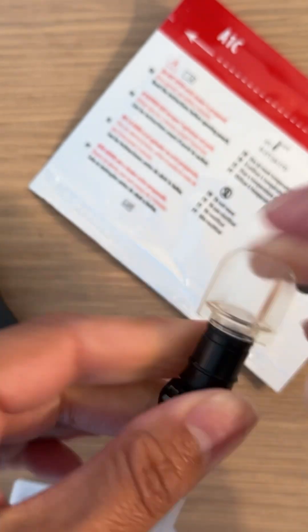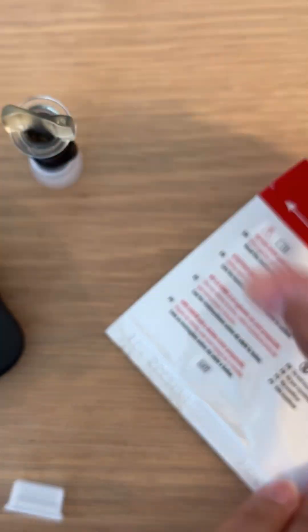You then put it in here and you shake it — shake it, shake it. Let's put that aside.